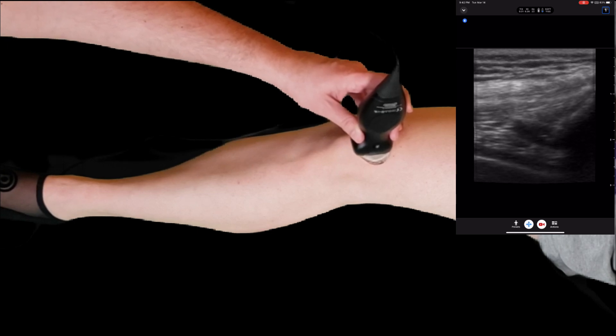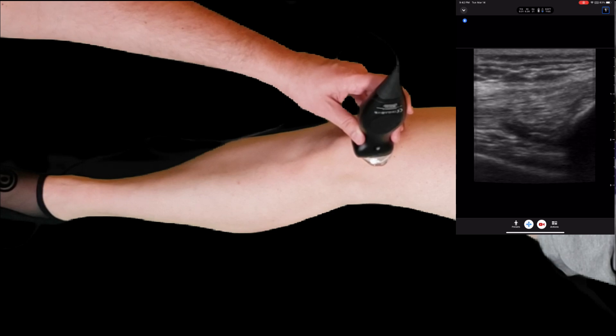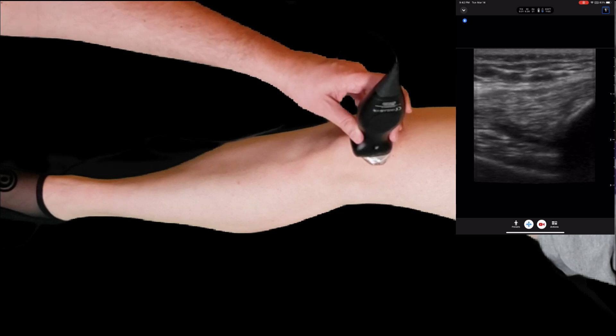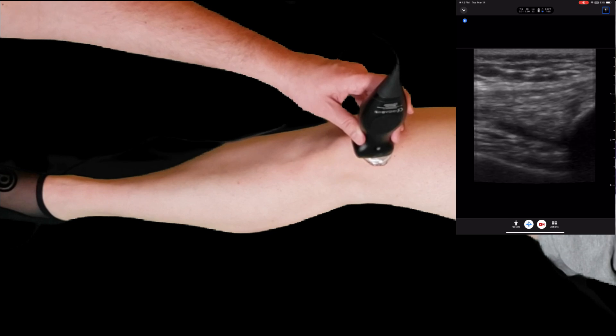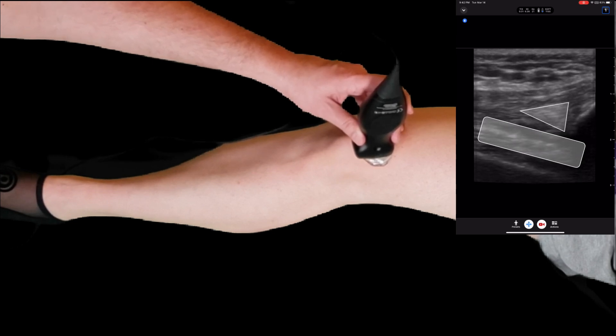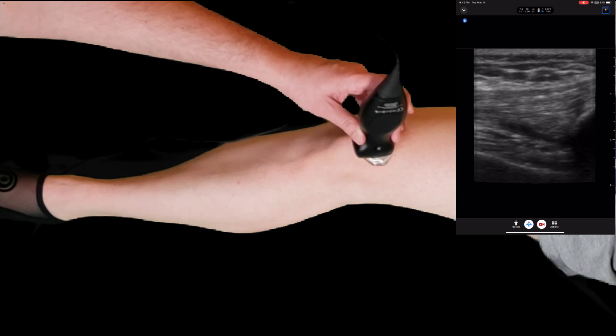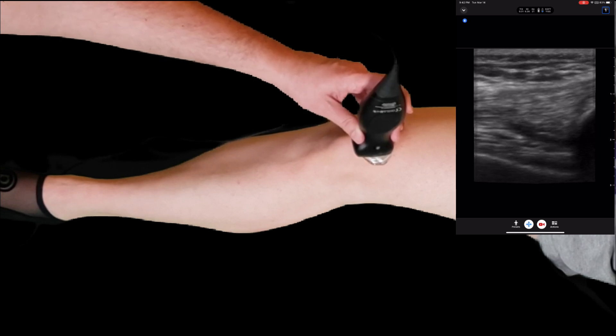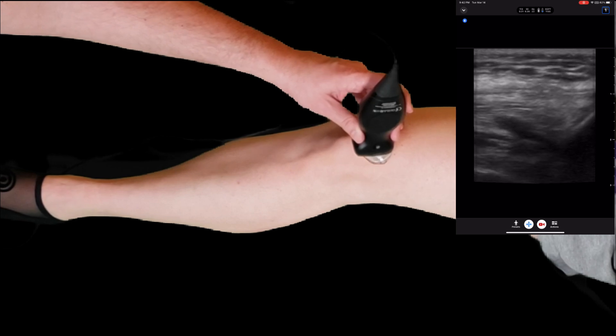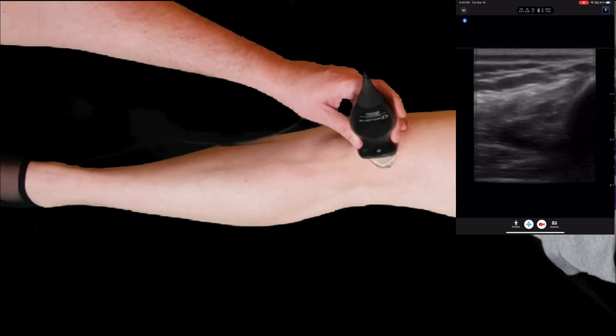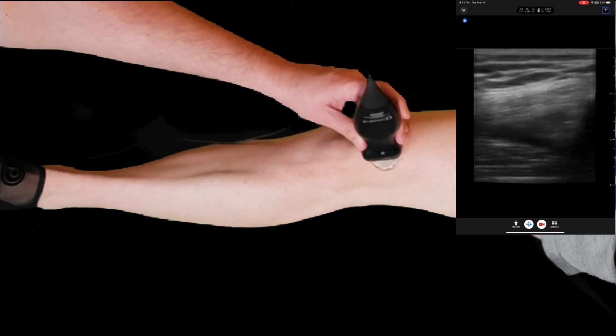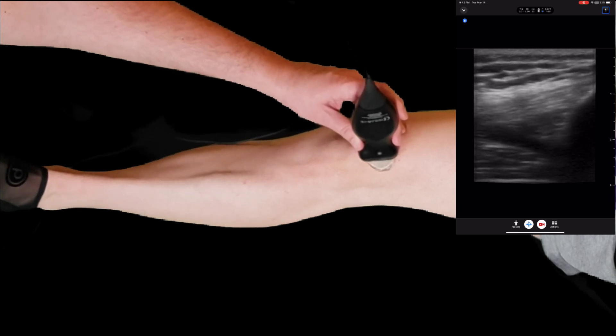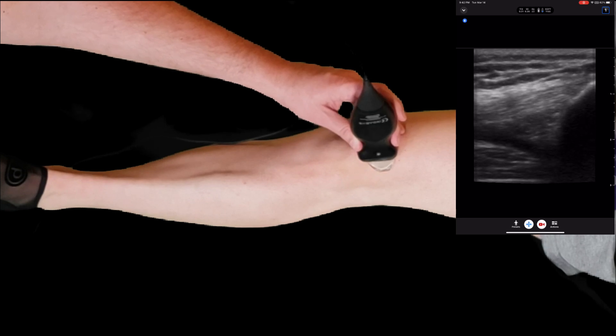If you're having trouble seeing an effusion, which would be this small potential space between the pre-femoral fat pad and the quadriceps fat pad, you can have your patient slowly extend their knee. That will force any fluid into that potential space, and you can have them relax the knee.